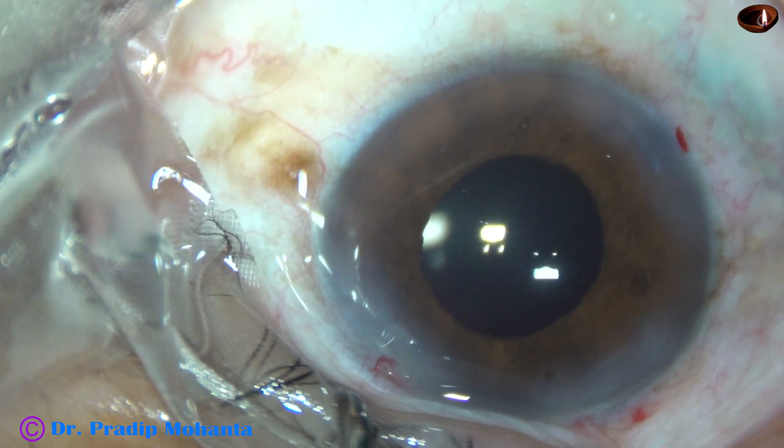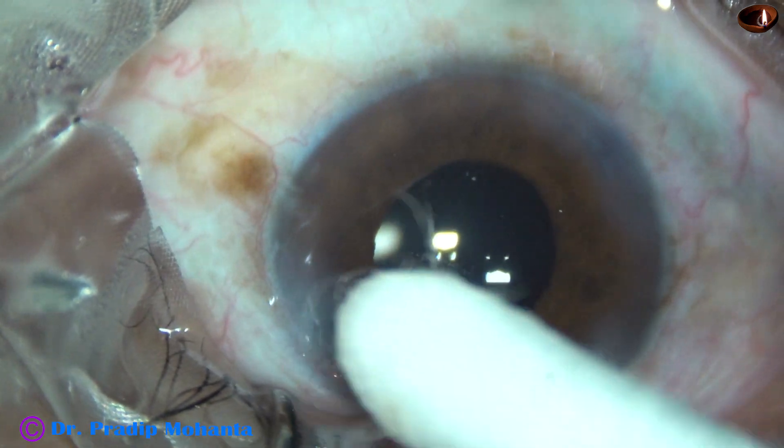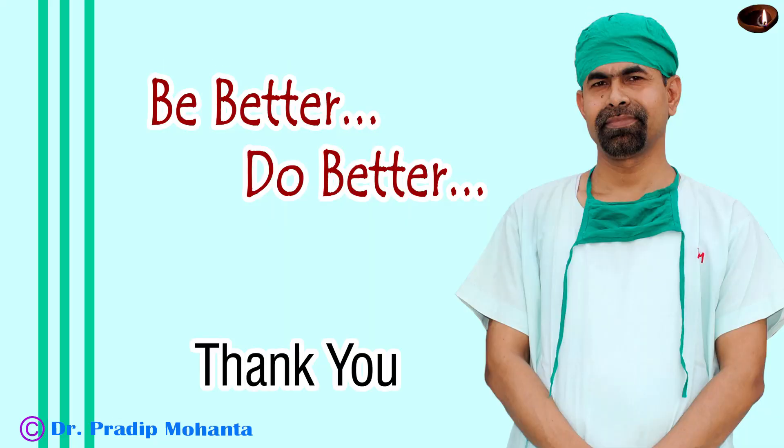There should not be any leakage from any wound. After that, a few drops of moxifloxacin are applied over the ocular surface and the case is concluded. So, if the nucleus is soft and if we can hold the nucleus easily, even if the pupil becomes as small as 3.5 mm during chopping and emulsifying the nuclear pieces, the case can be managed easily.